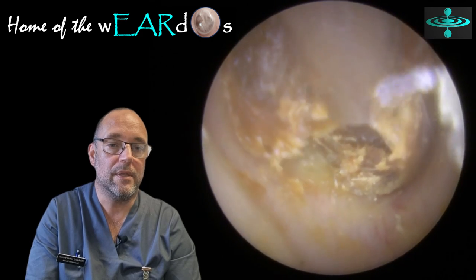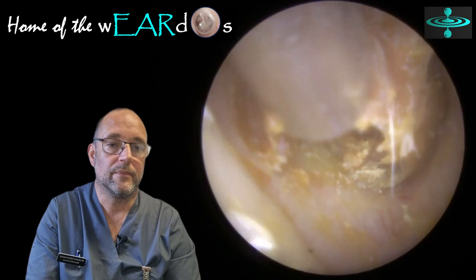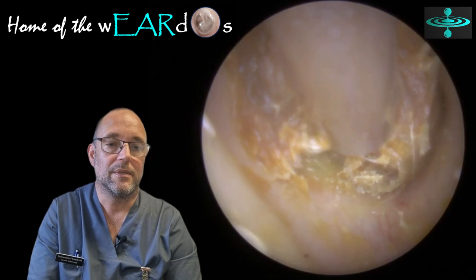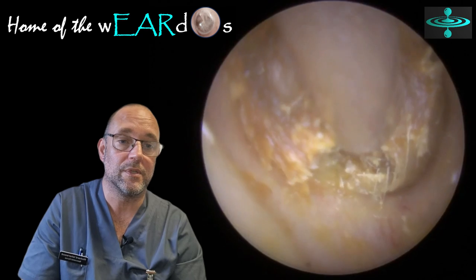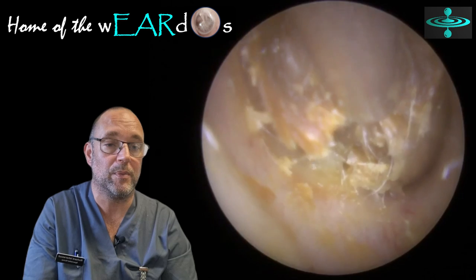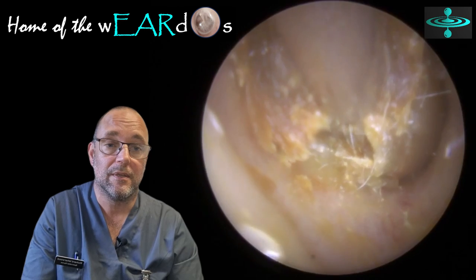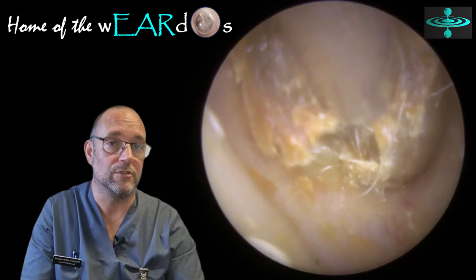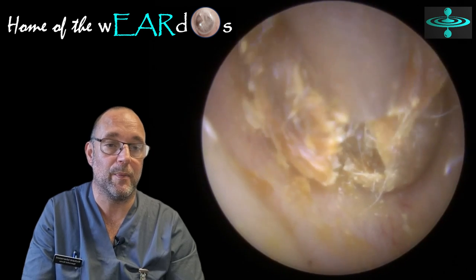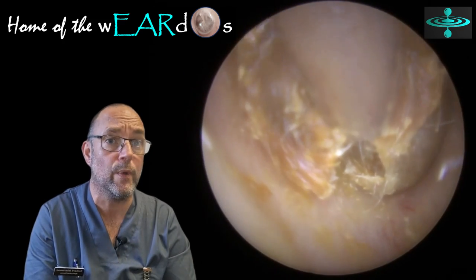But it is coming. This fellow was very, very patient. He'd always just assumed he was going to be deaf — like a lot of older people do. A lot of older people think it's just age-related hearing loss. Sometimes it is, but more often than not they've got something like this in there. They're always very relieved and very happy when we find something like this and get it out, and then the hearing is restored. That's why we like doing this job — it's a quick win.